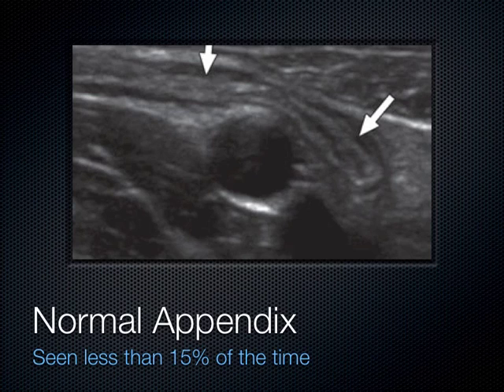This is an 18-year-old woman who had lower abdominal pain. We can see here this tubular blind-ended structure here. Nice thin walls, certainly less than 5 millimeters down there, right adjacent to her external iliac artery seen right here.